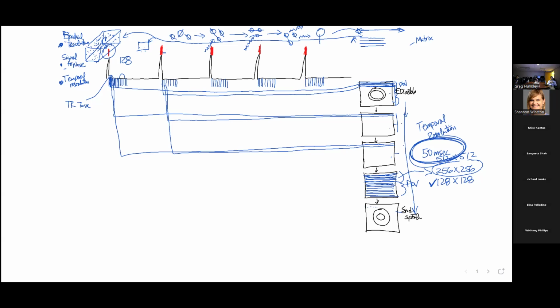So you hear breathe in, breathe out, breathe in, hold your breath. Or breathe in, breathe out, breathe in, breathe out, hold your breath. You have to account for the respiratory motion, right? So you hear all those instructions, and then after that, you hear this kind of constant sound.